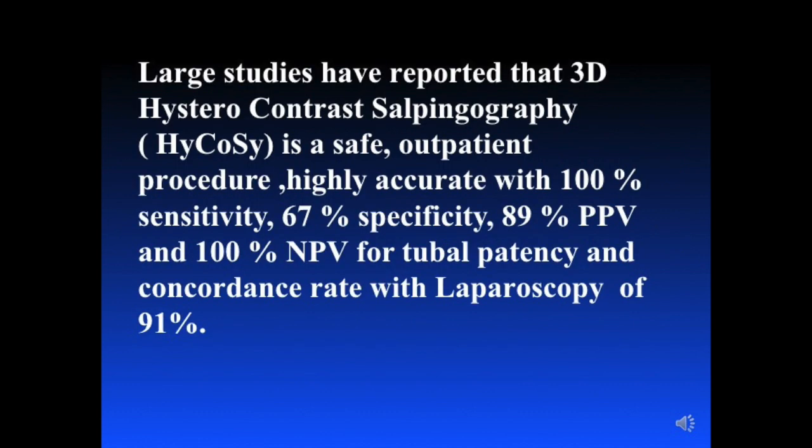Large studies have reported that 3D hysterocontrast salpingography is a safe outpatient procedure, highly accurate with 100% sensitivity, 67% specificity, 89% positive predictive value, and 100% negative predictive value for tubal patency, and about 91% concordance rate with laparoscopy.